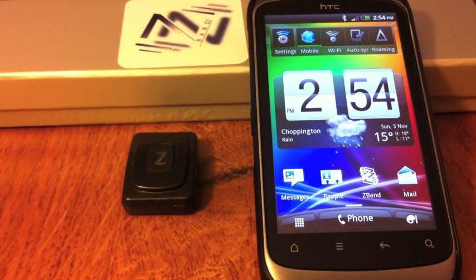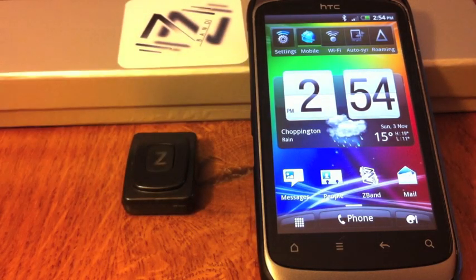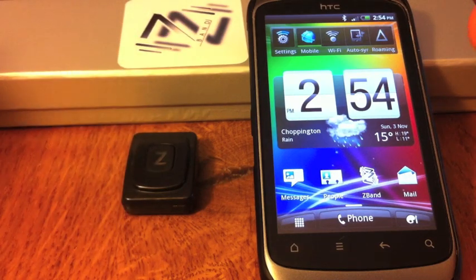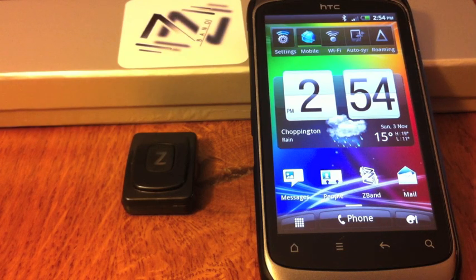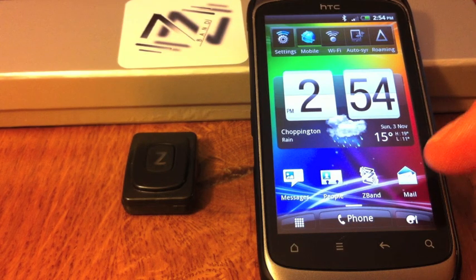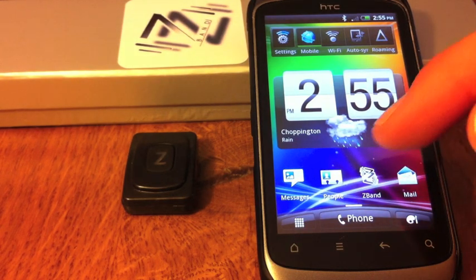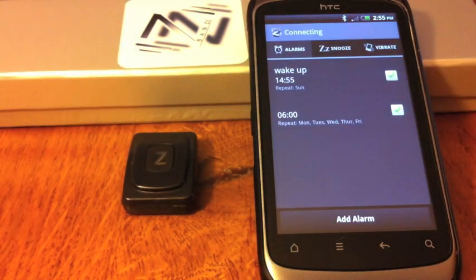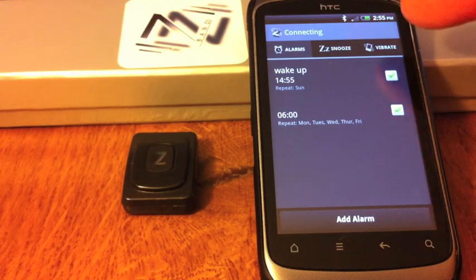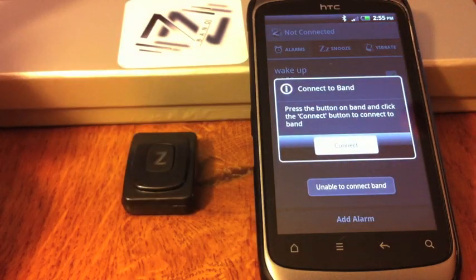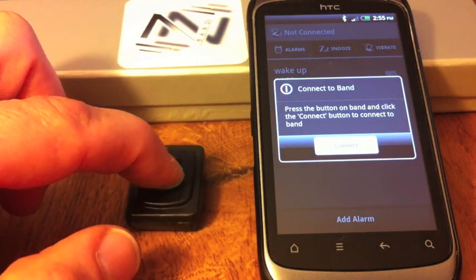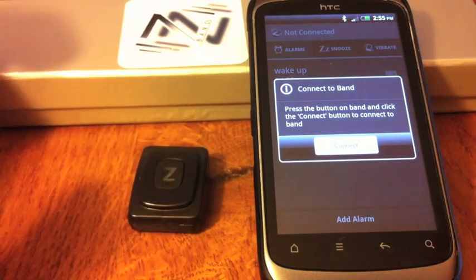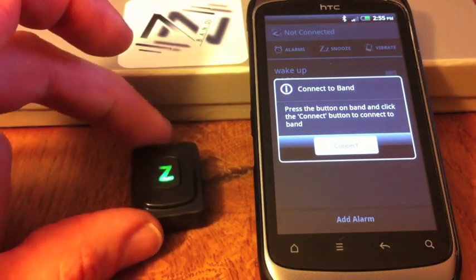Earlier on, I mentioned you have to pair the Z-Band device through Bluetooth. Now, that's either with an Android or a Windows phone. I've got in front of me here an HTC Desire S. So that's an Android. You go to the Google Store and download the Z-Band app. As you can see here, I've got it on the front screen. So what we do is we click on the Z-Band app, and you've got a number of functions here. Alarm, snooze, and vibrate. Now, what will happen is it will try and connect. In order to connect it, you have to press and hold, and you get a little vibration of confirmation of the Z-Band.